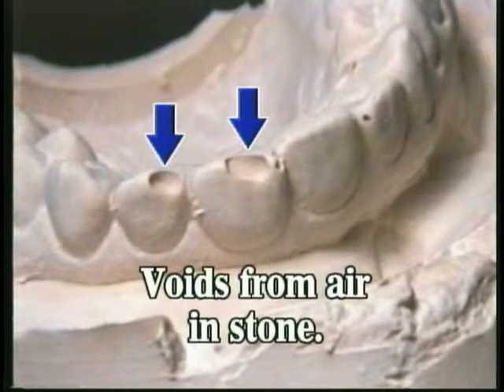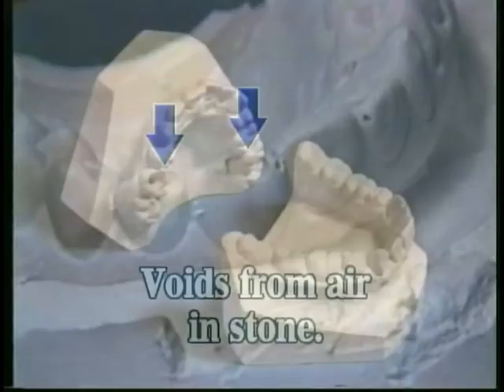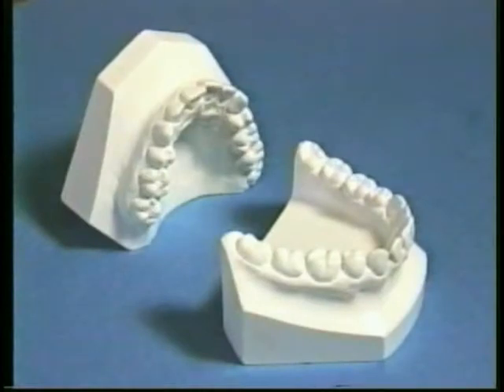A model like this is useless, and now the patient must come back in for another impression. This will not make the patient nor the dentist happy. Dental stone is extremely hard if the proper water and powder mixture is used. Too much water will result in a weaker stone.